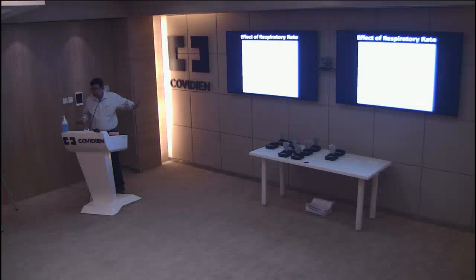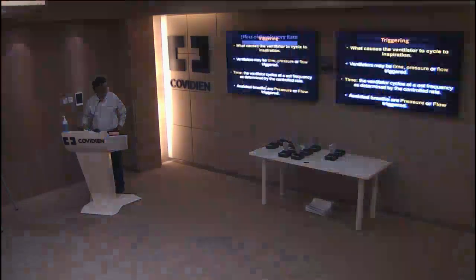So always look at inspiratory time. Whenever you calculate, say this is the inspiratory time I've set, so that means now the patient is going to get only so much time for expiration. Quite often we're leaving too little time for expiration by not shortening the inspiratory time in patients who have higher heart rate, higher respiratory rates. And that's what causes the hemodynamic instability, auto PEEP, etc.